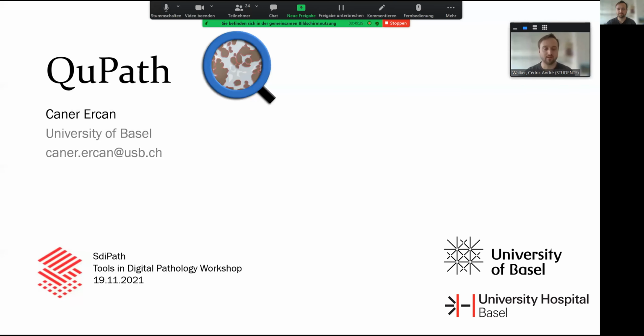Hello everyone, thank you Cedric for the introduction. I'm Caner, I'm working at the University of Basel as a PhD student in the Pathology department. I'm not a developer of Qupath, I'm just a fan and also a user of Qupath.